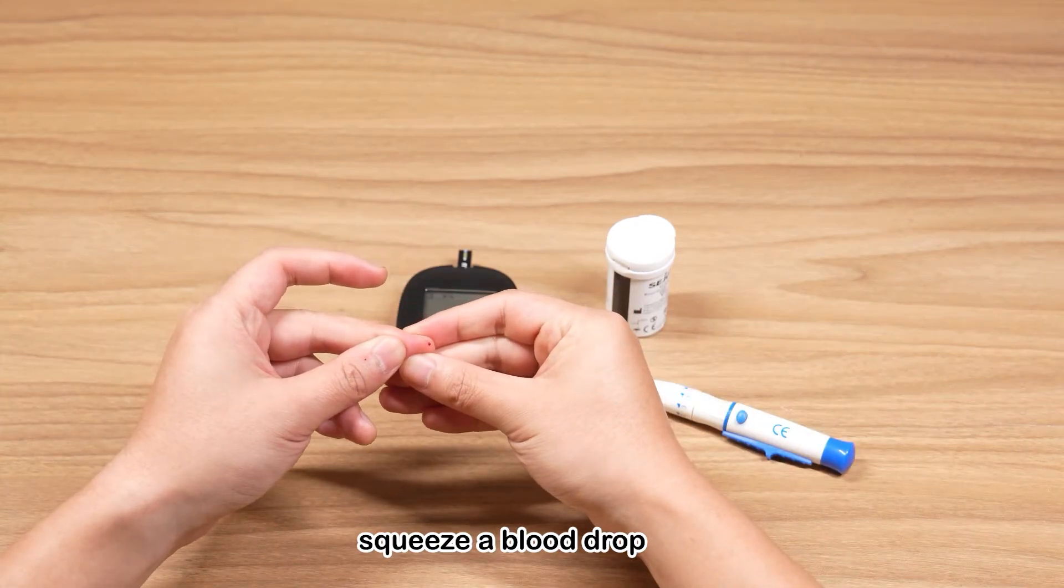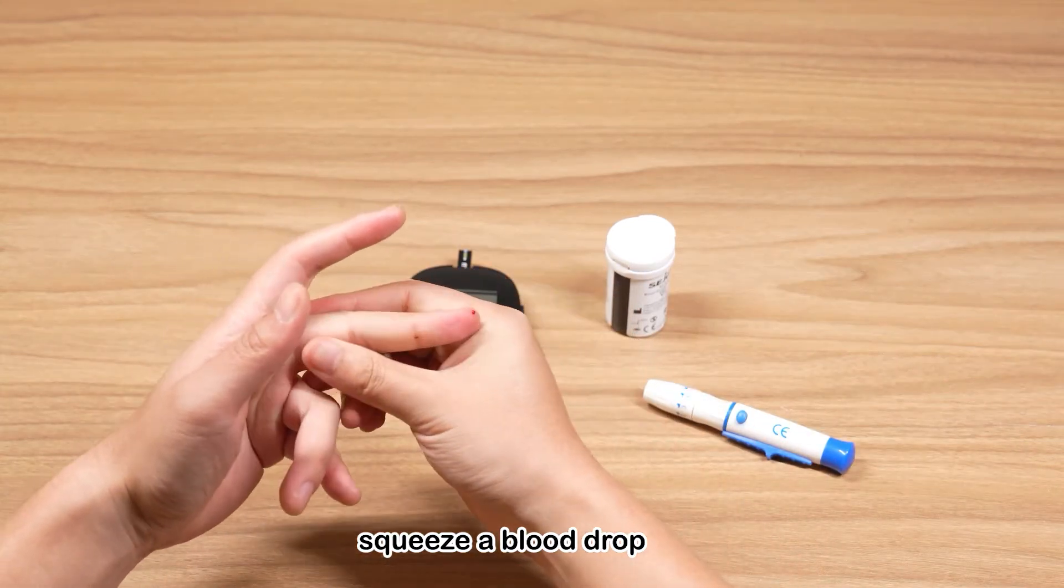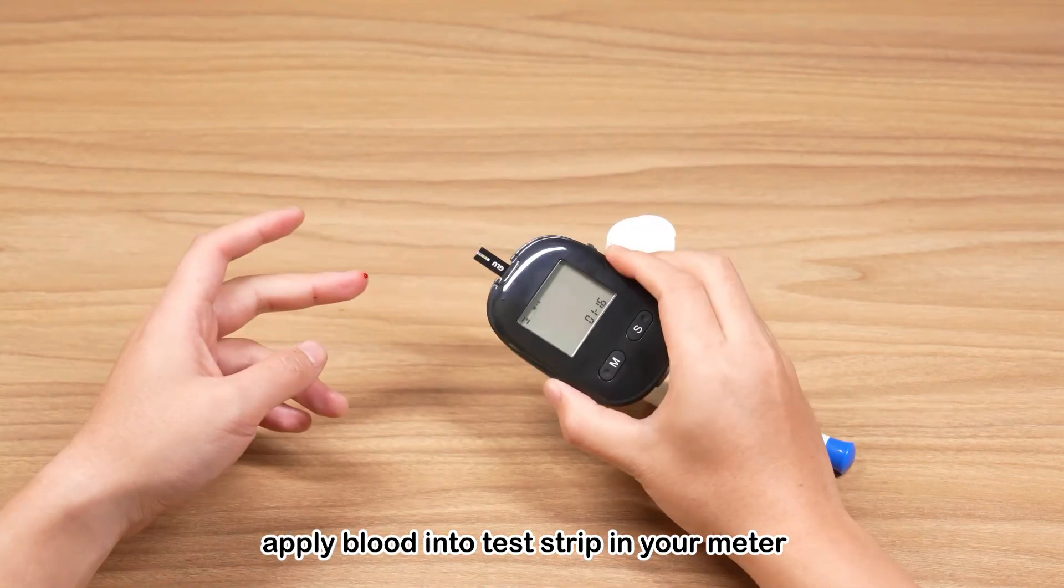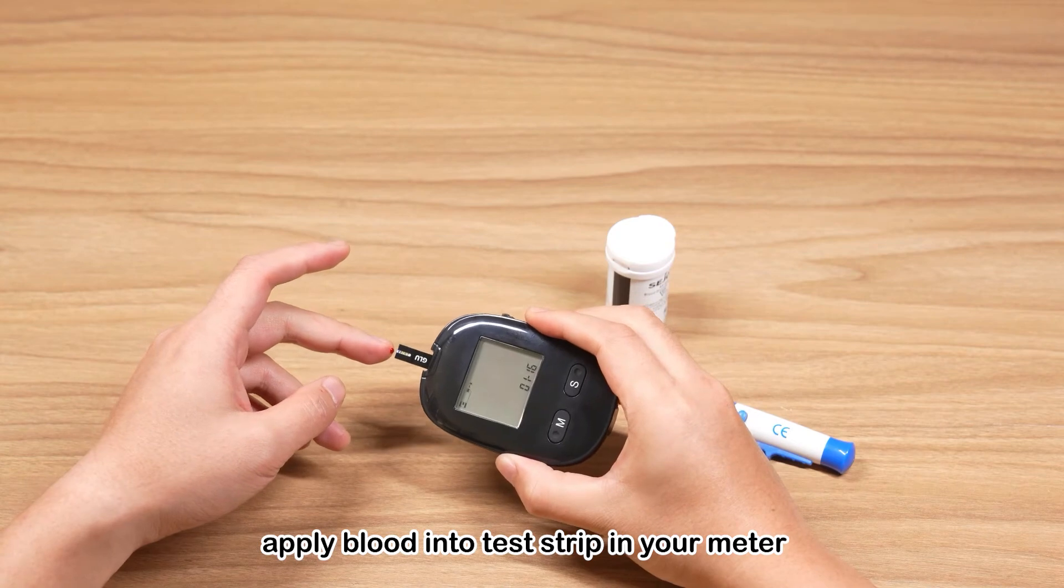Gently squeeze your finger until one small drop of blood is visible. Apply the blood drop into the channel of the test strip until the channel is fully filled.